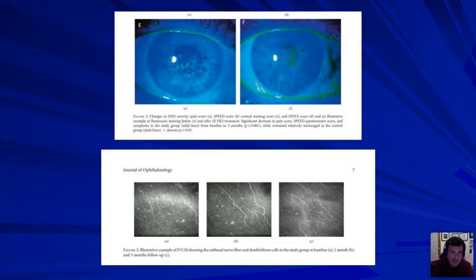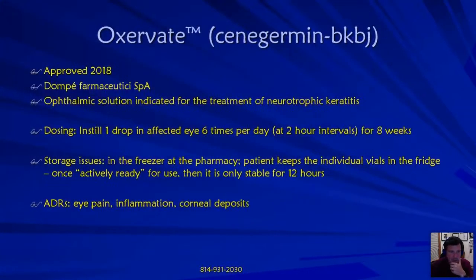How many times have you had someone that comes in, maybe like this patient, and you reach from behind the microscope and you say, you sure you don't feel anything in your eye? You don't have any feeling? That's the stain without pain, right? It's that little rhyme, stain without pain. How many times have you seen half an amount of staining and the patients are just miserable? Well, when you see that stain without pain, start thinking neurotrophic or corneal nerve loss. So this would be potentially a good indication when to use a cryopreserved.